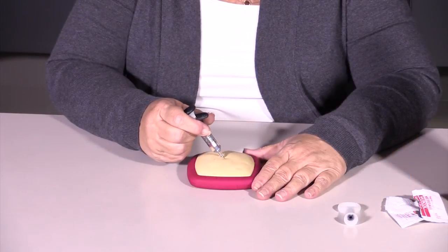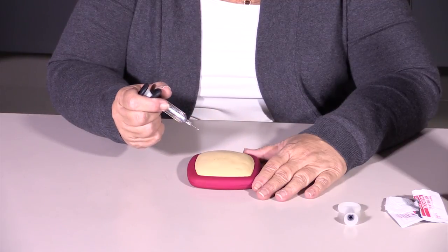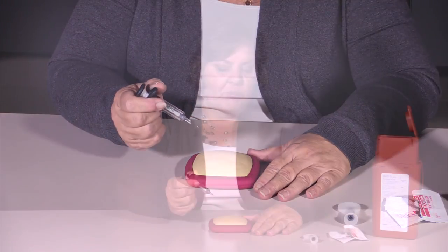Once it has entered, you pull the syringe back out the exact same way and deposit it in your sharps container. That's all there is to injecting Symsia.